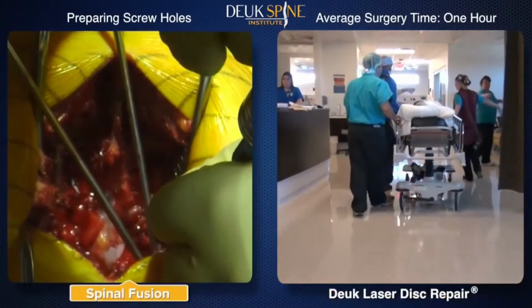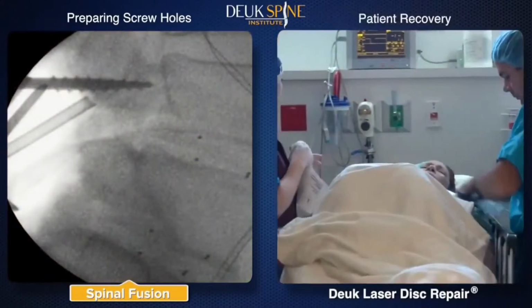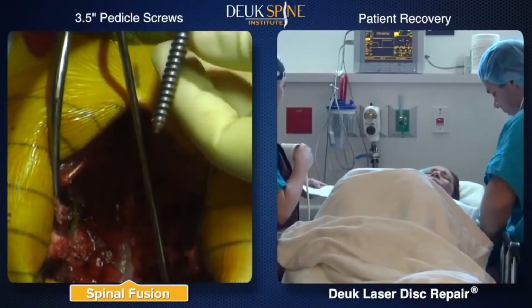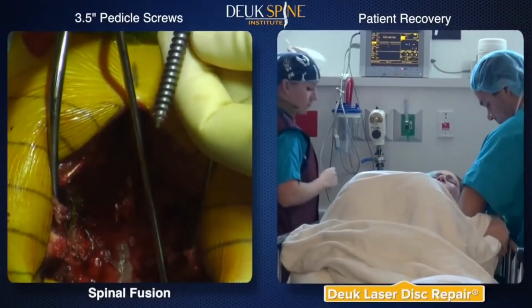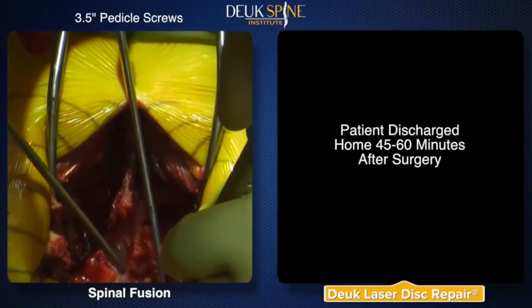The fusion, however, is still underway. Holes in the spine must be tapped in preparation for the large pedicle screws that anchor the fusion hardware. The Deuk laser disc repair patient is in recovery usually 45 to 60 minutes before released to go home.